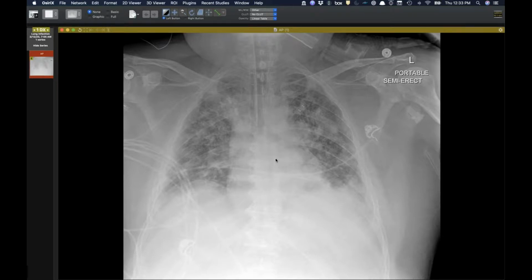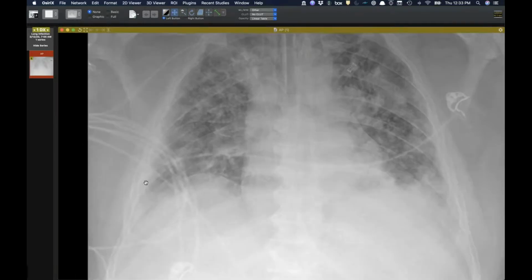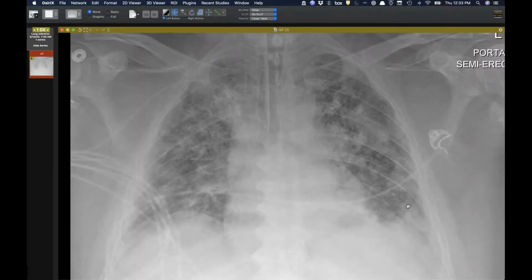And it looks as if he may have pleural effusions too. Perhaps, yeah, actually I wonder if he has a rib fracture there, especially on the left. I don't know if he's had to be resuscitated yet or not. So this was one of the questions I had coming out of the STR meeting, because a lot of what we're seeing, like Jeff was saying, is earlier disease. I was wondering about the patients that are going downhill, what do they look like? And as you imagine, they look like this.